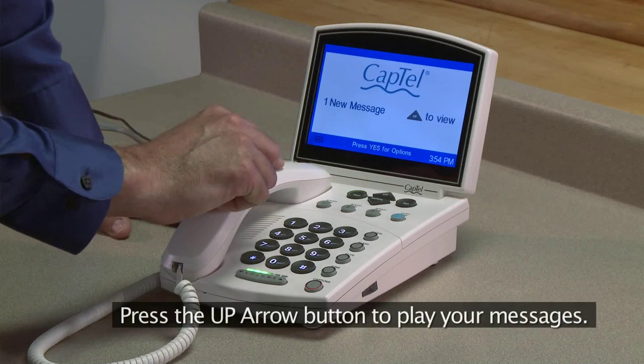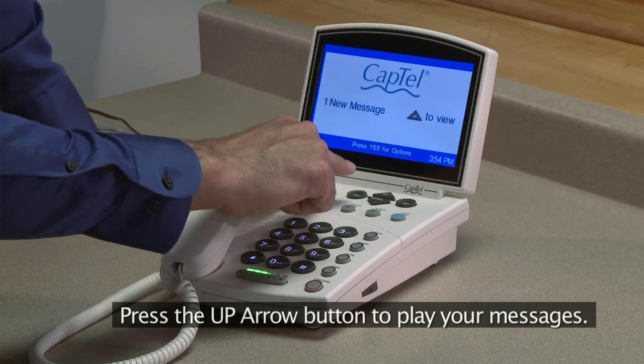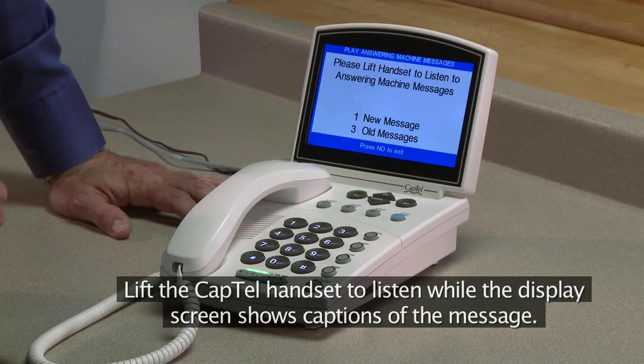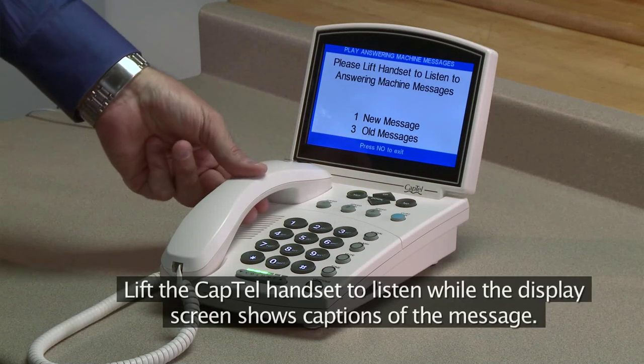Press the Up arrow button to play your messages. Lift the CapTel handset to listen while the display screen shows captions of the message.